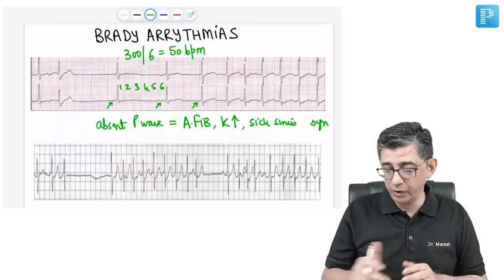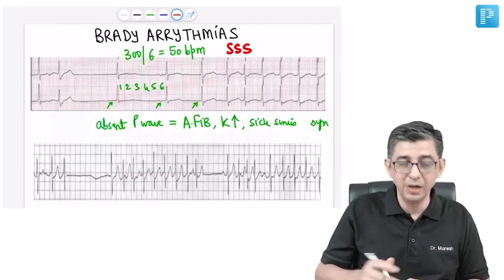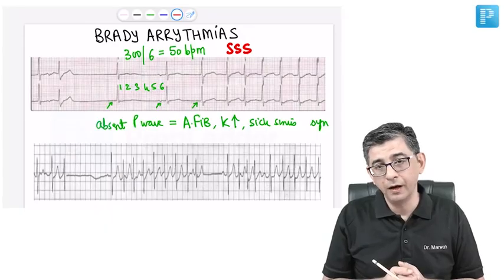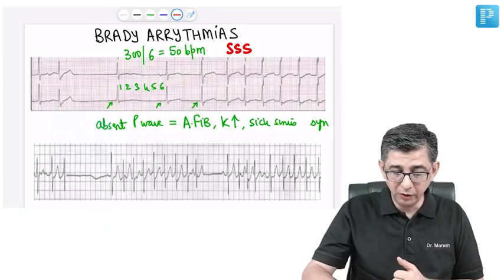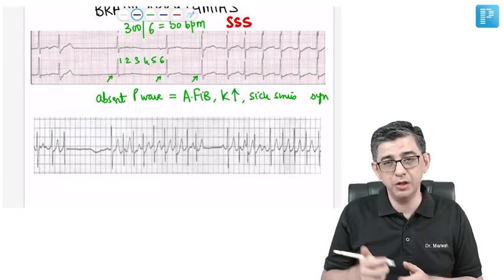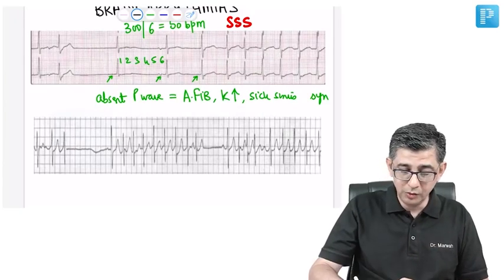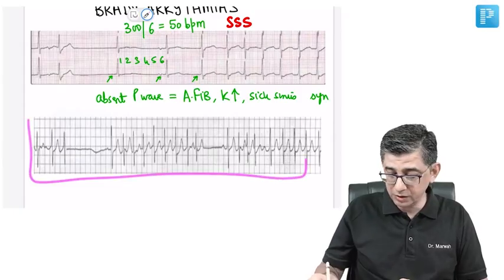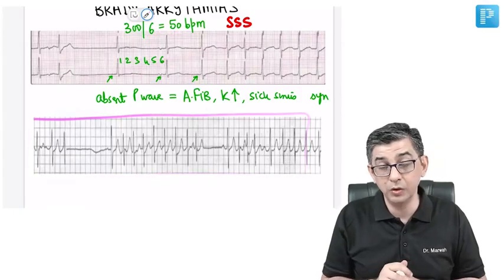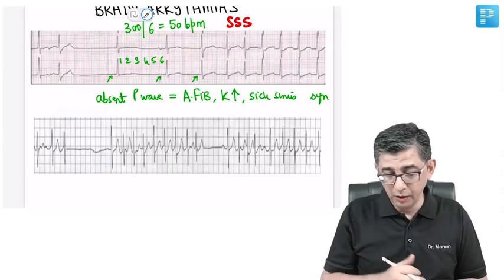So I am beginning the bradyarrhythmia topic by describing what is called SSS, that is sick sinus syndrome. Now in sick sinus syndrome, another very peculiar problem comes, which was actually asked in the FMG exam. Honestly, I did not anticipate that they were going to ask this particular ECG in the FMG exam. It was actually a two-step question. So listen to this very carefully, especially if you're sitting for the FMG exam.